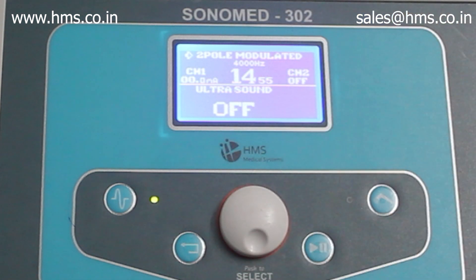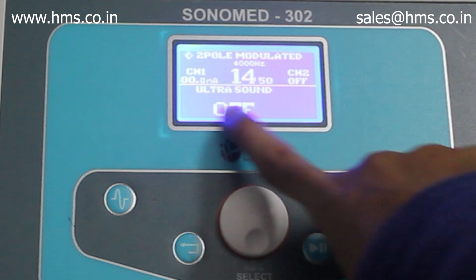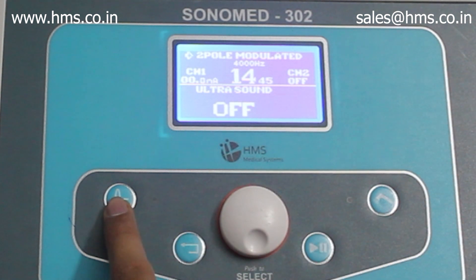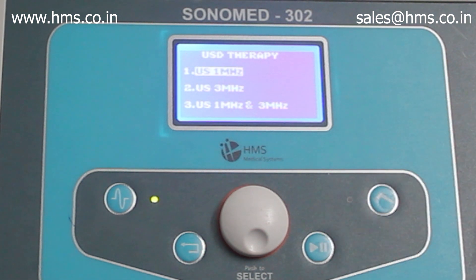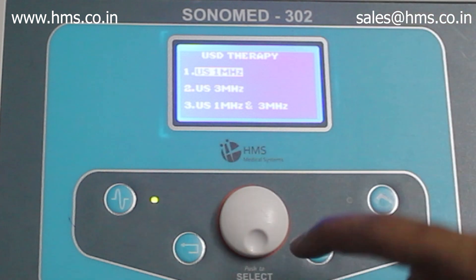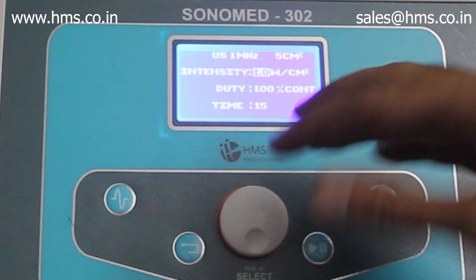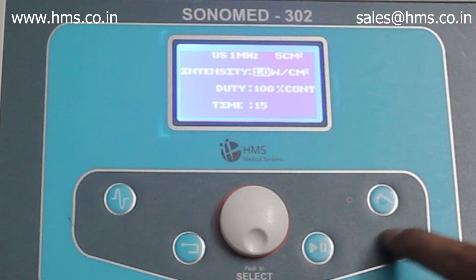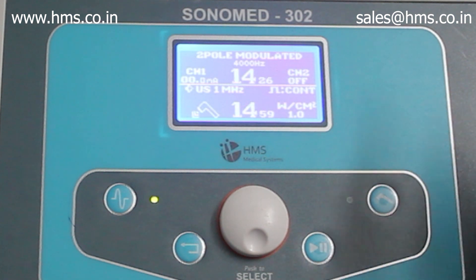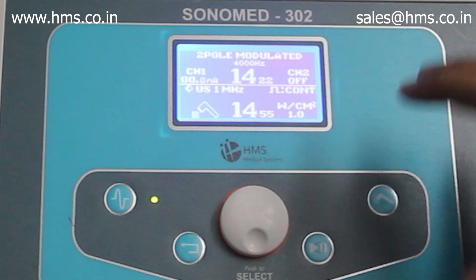To use ultrasound at the same time, the bottom portion of the screen represents the ultrasound parameters. This is the ultrasound button and this is the electrotherapy button. To select ultrasound, press this button and set your required settings for ultrasound therapy. I'm setting 1 MHz and the required parameters, then pressing the start button. Now both ultrasound and electrotherapy are running at the same time.